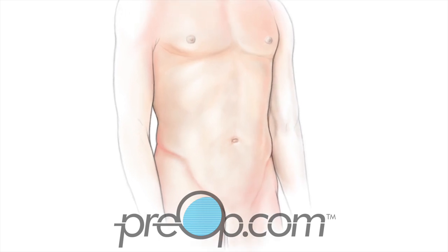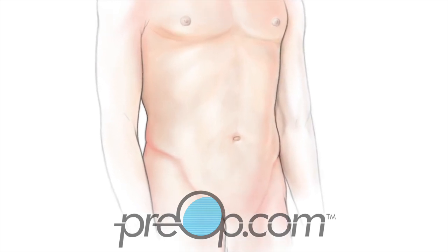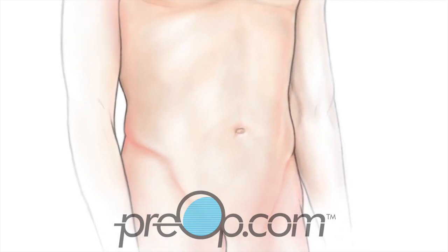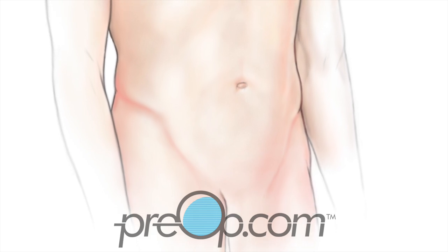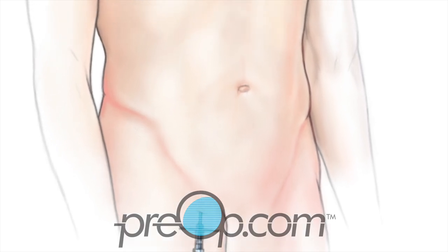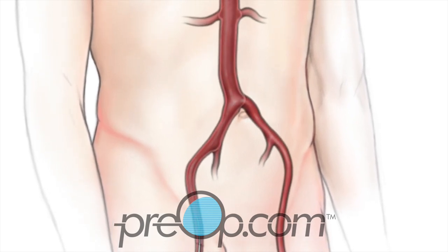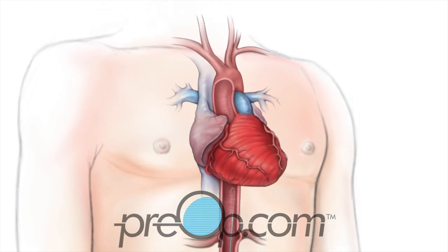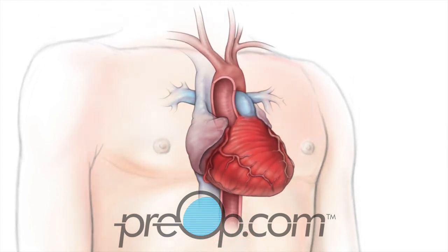For your cardiac catheterization procedure, you will be positioned carefully on an x-ray table. The skin over an artery of your leg or arm is cleaned, then numbed with local anesthetic. You will feel a sting and burn that lasts only a few seconds. A tiny cut is made over the artery and a guide for the catheter is placed. You may feel pressure but you should not feel pain.